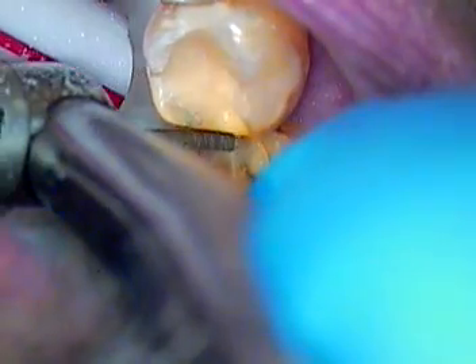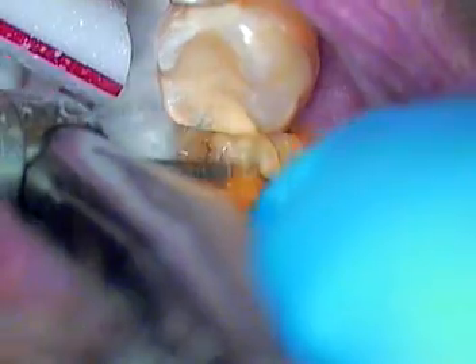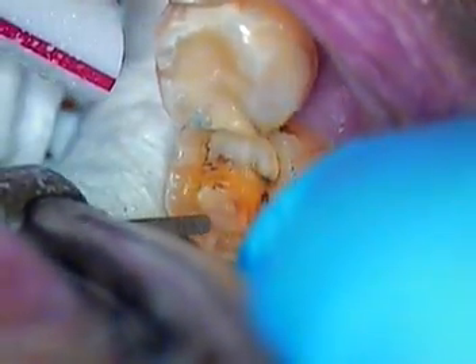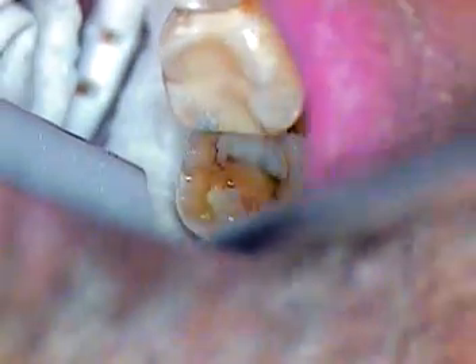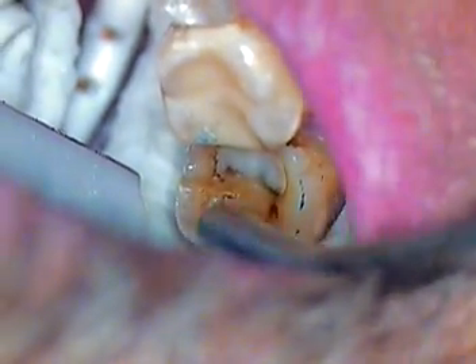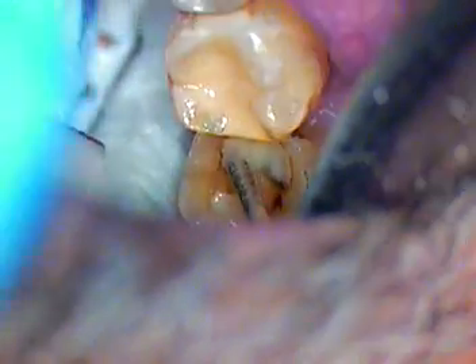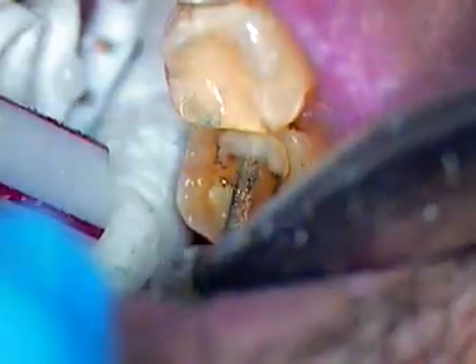Now coming up to the mesial marginal ridge and reducing that. Okay, so again just smoothing the occlusal surface, and now what we'll do is we'll do our vertical cuts.